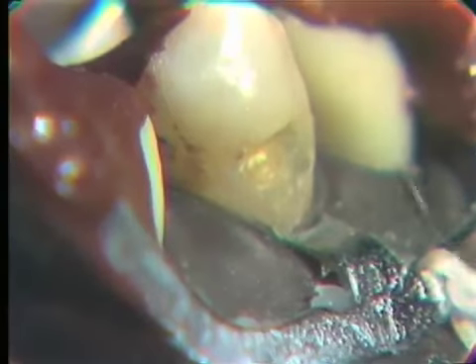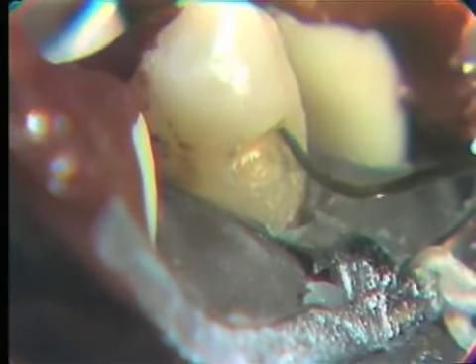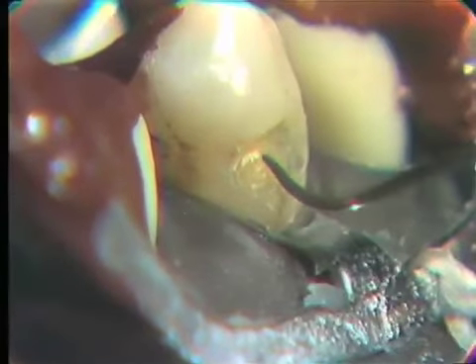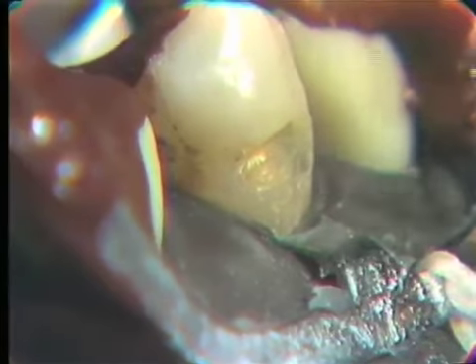Now the occlusal groove, a little more difficult to see, but again, a groove that goes from the distal to the mesial, about half the depth of a quarter round burr in this particular cavity preparation, half to 3/4 of the depth. Not cut into the axial wall, but cut into the occlusal wall and into the cervical.